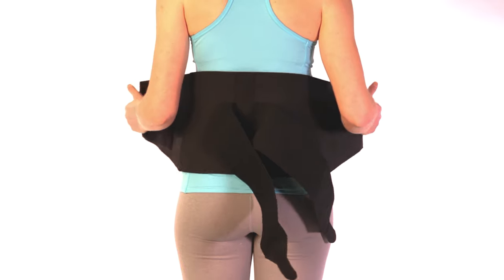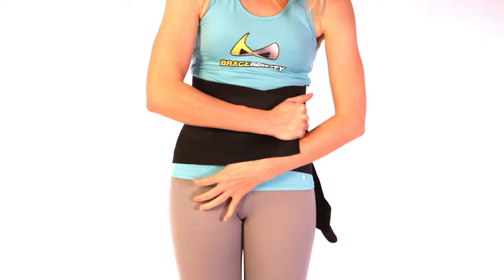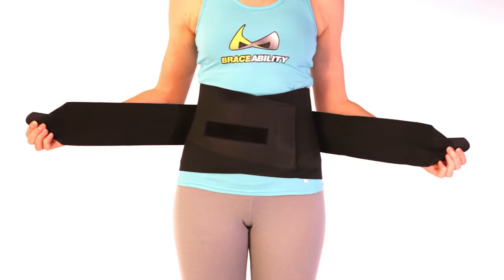Fold the left side of the brace towards the middle of your stomach. Do the same with the right side, pulling firmly, and secure the closure. Repeat this process with the double pull tension straps for your desired compression level.